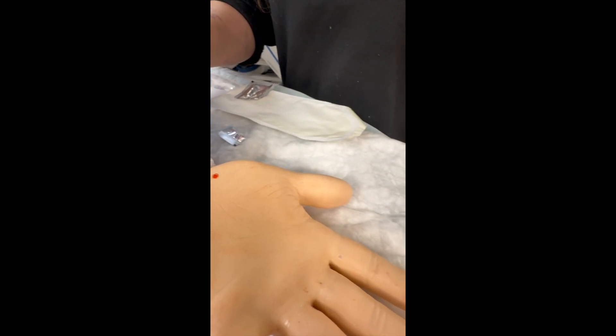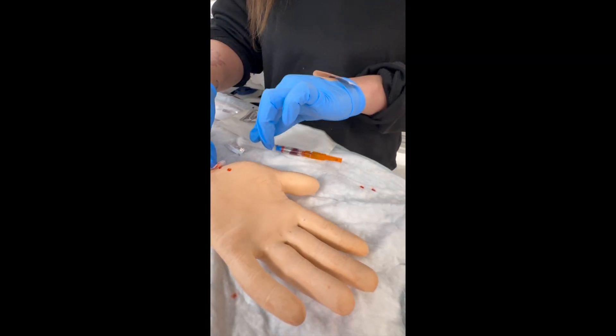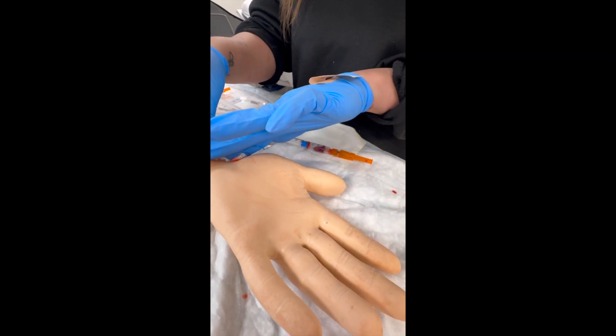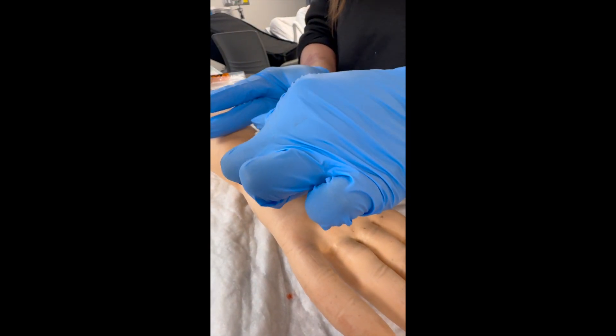There's a safety cap to keep you from pricking yourself that you will close. Continue to compress the site until the bleeding stops. Once the bleeding has stopped, you can apply a bandage.